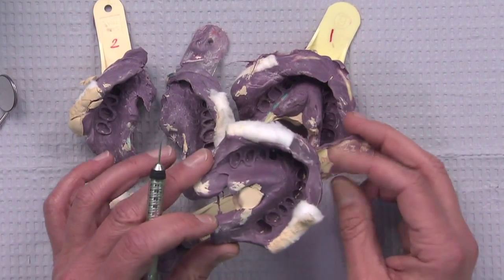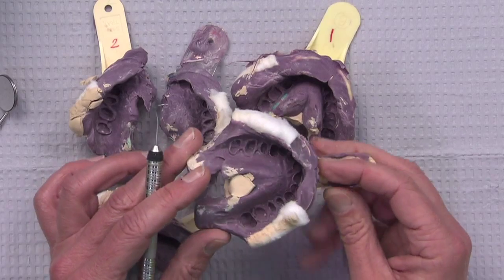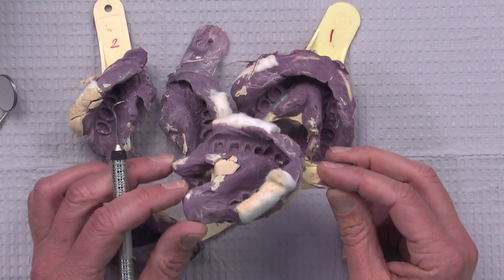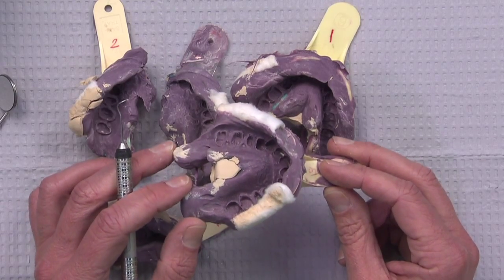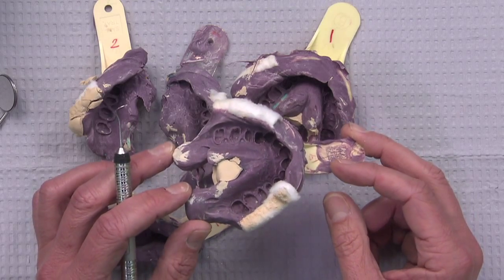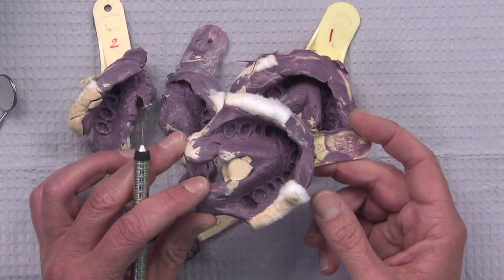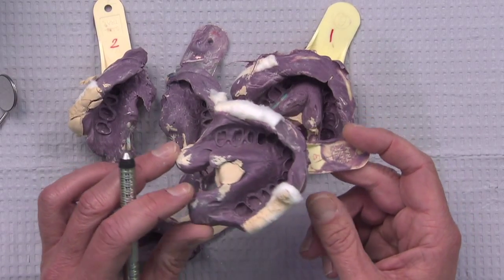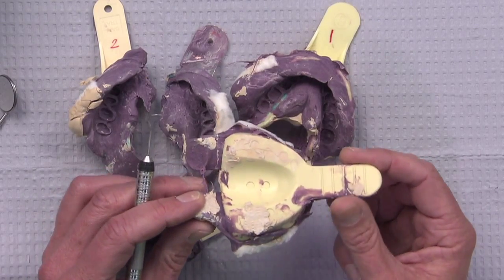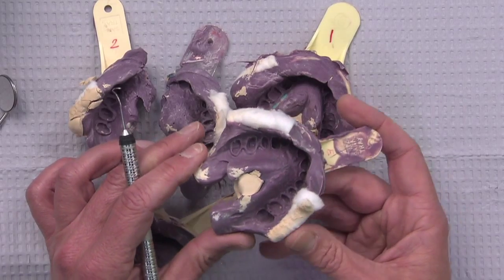I'm okay with a tray like this, a stock plastic tray. I use all custom trays, but I cheat a little bit because I'm practicing inside the laboratory. I realize if you could snap your fingers and get a free custom tray like I do, I don't pay for them, you would do it as well. So all I can tell you is that I get good results. Some dentists will take the next step and make them in their own office or actually ask for them, but when I was out in private practice, I was using trays like this all the time. And as long as they fit well, and this one appears to, great, no big deal.